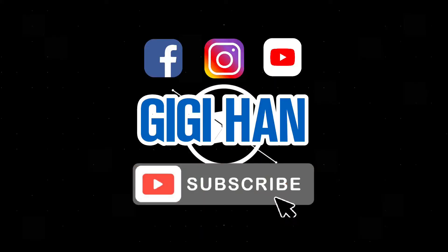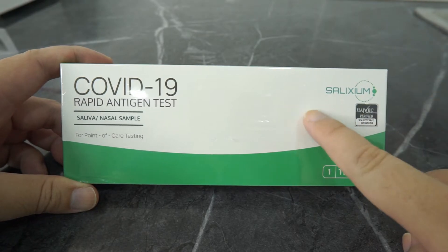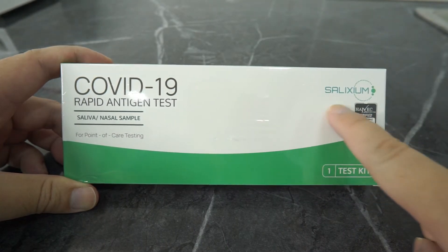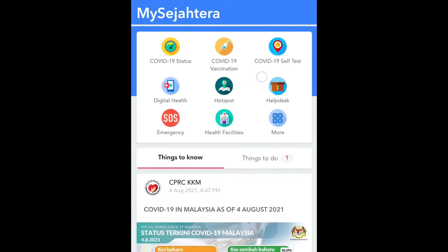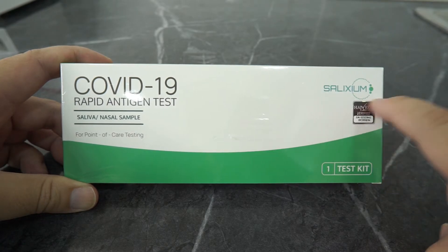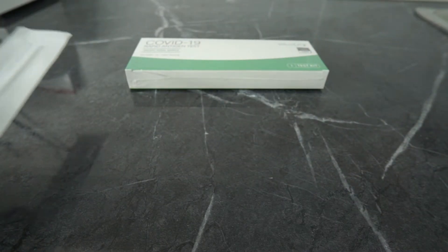Hi guys, welcome to Kiki Han channel and today we are going to look at Salixium, the first made in Malaysia COVID-19 rapid antigen test kit. For your information, this is for home self-testing only. If you are tested positive, please update your self-test result in MySejahtera and also contact your nearest government clinic or hospital. You may need another round of PCR tests for confirmation if you are tested positive with this test kit.